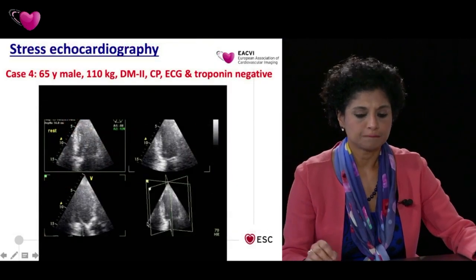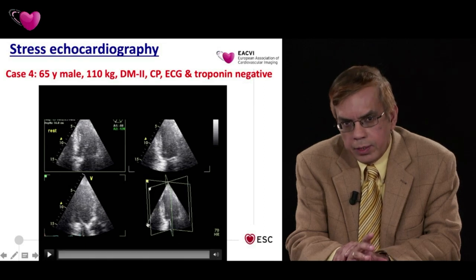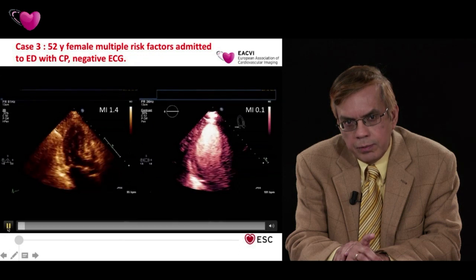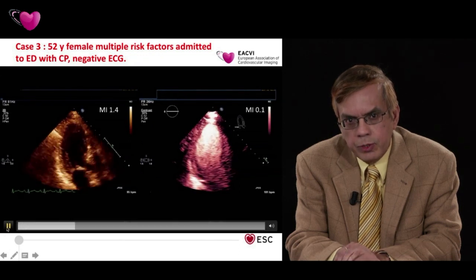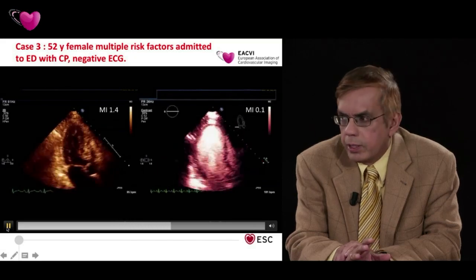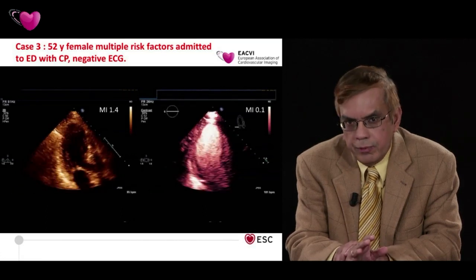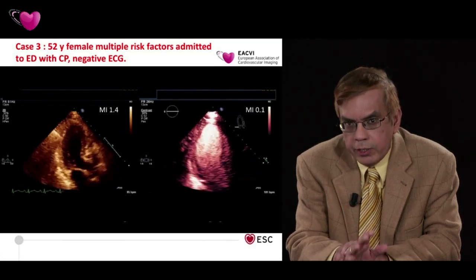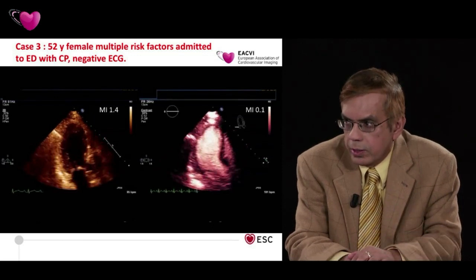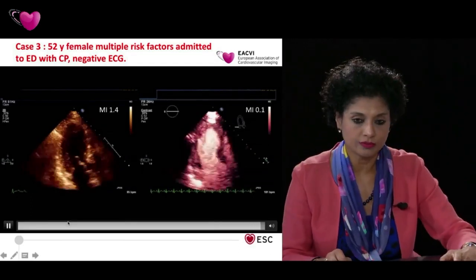And the reason why you see clearly moving myocardium in the non-contrast, if you just go back a slide and play that again, is that it's not the muscle you're seeing there, it's trabeculae. Right. And with contrast, you remove those trabeculations, you don't see them, and you see the compacted myocardium. Therefore it more accurately assesses compacted myocardium than the non-contrast images. Absolutely, and which also gives the higher volumes, in fact.